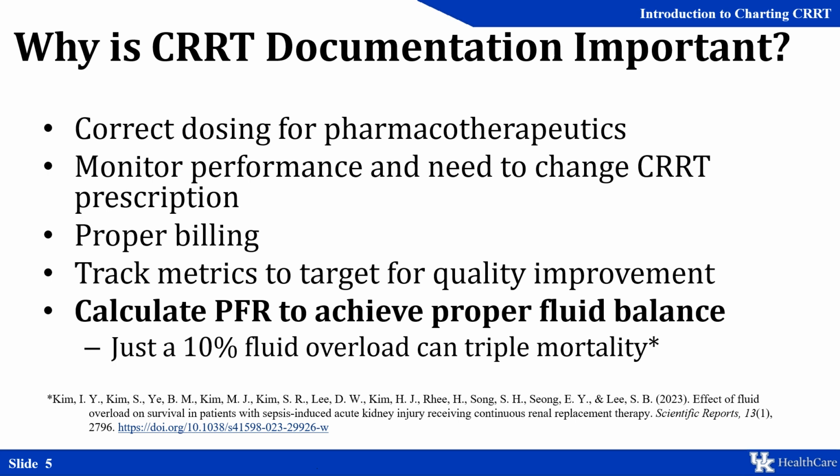We also use documentation for proper billing. We don't want to be over or undercharging our patients. And we also use it to track metrics for quality improvement. After all, if you don't measure something, you can't make it better.